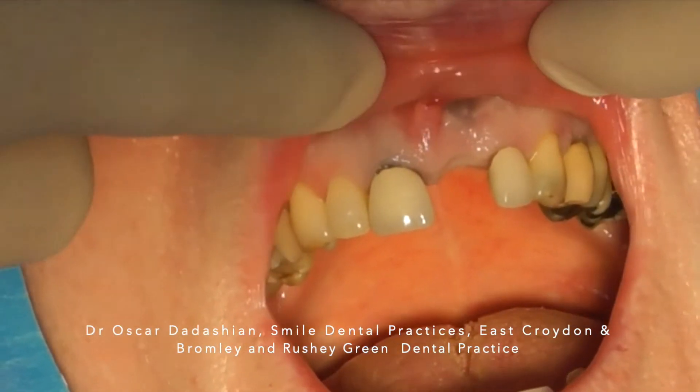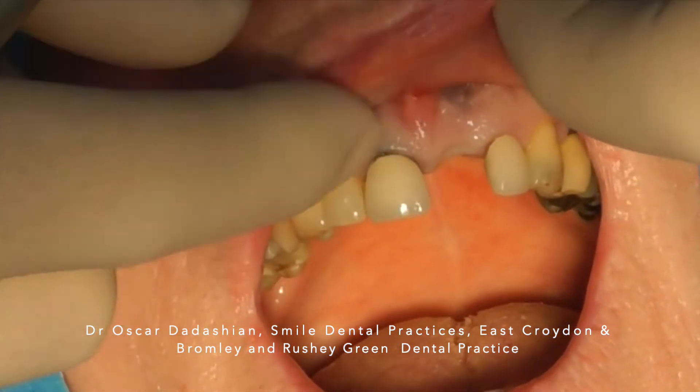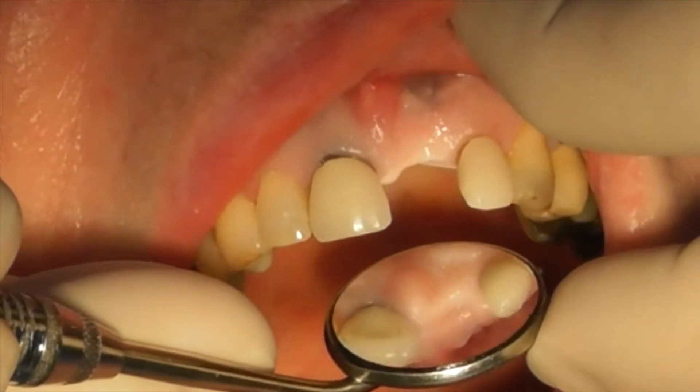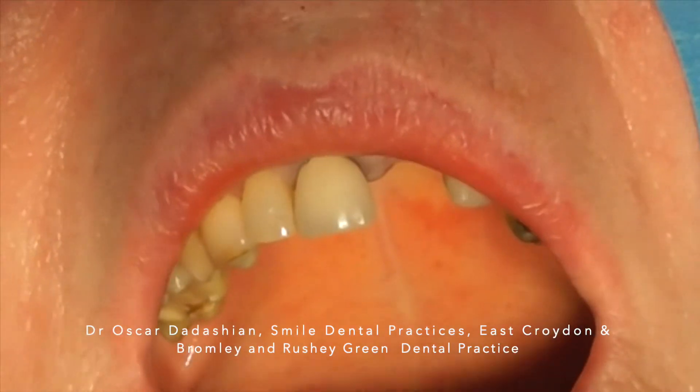At the time of implant placement, as you can see we have good height of bone, the soft tissue has not collapsed, and we have plenty of keratinized tissue.